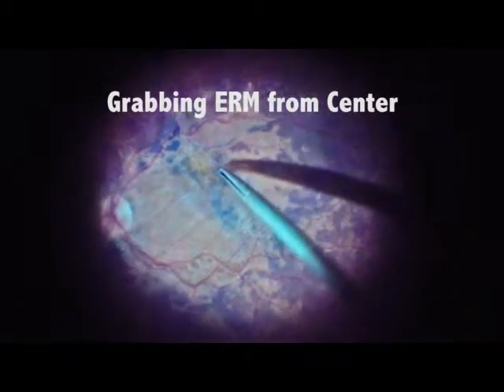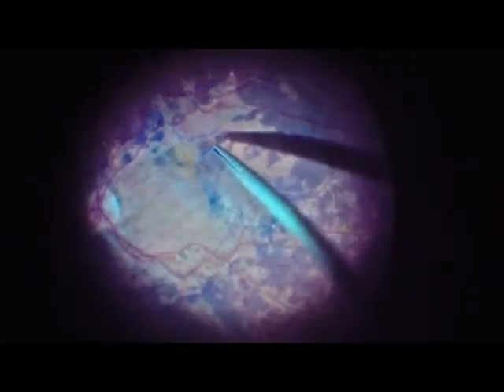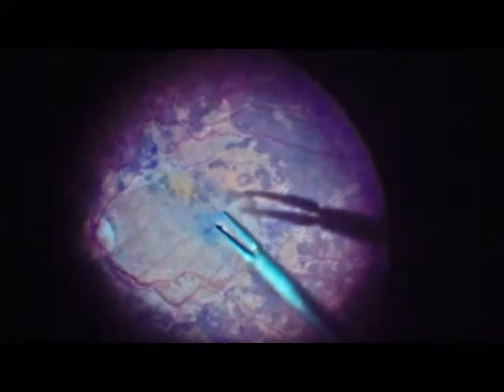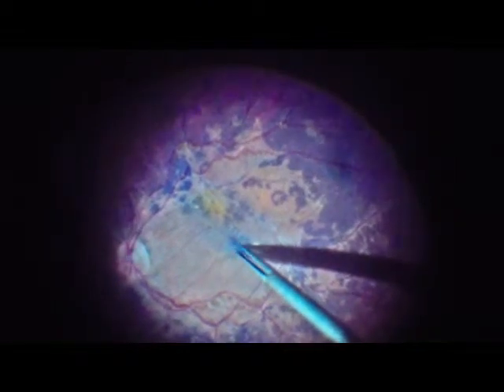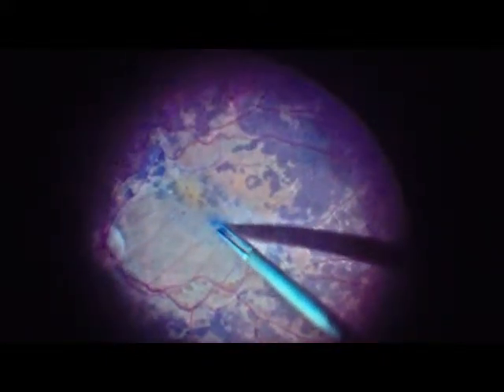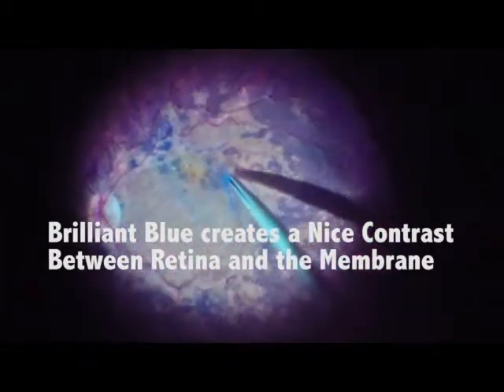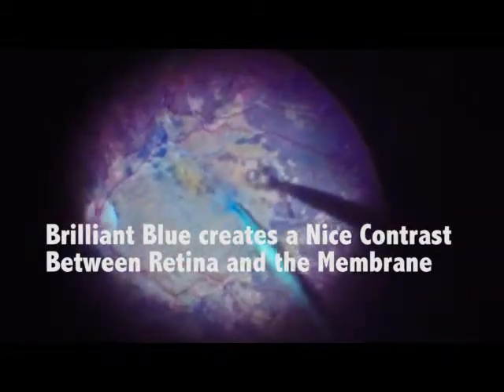That did not quite happen because we had an early split from the membrane. Still, we went after the membrane edges and continued the epiretinal membrane peel. We notice that the brilliant blue creates a nice contrast between the retina and the membrane, thus allowing a good grasp from the retinal forceps. So we carried on the epiretinal membrane peel 360 degrees.